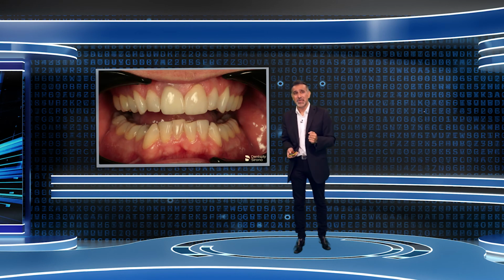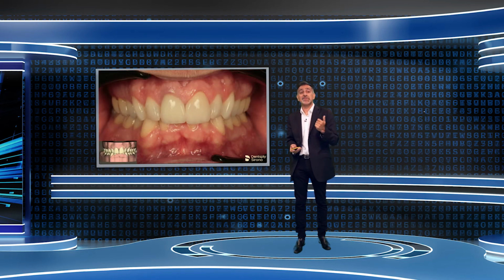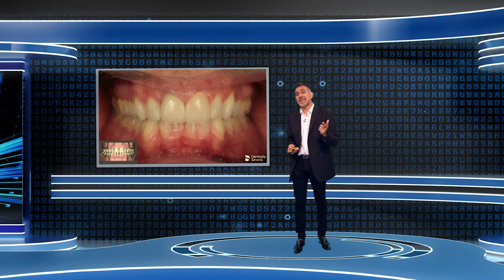This is exactly what we did with this case. You can see this patient's start position. We did these upper veneers on him. I did these upper veneers about 10 years ago, actually, and they looked okay, but you can see how they moved over time, and this patient's bite has clearly deepened, teeth had moved, but now we've aligned the teeth and done a bit of upper and lower restorative treatment on the edges as well. And you can see the predicted outcome on the lower left side of the screen, and then the actual outcome in front of us, okay?